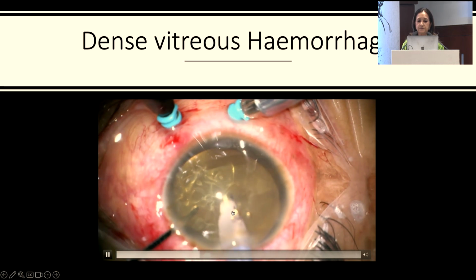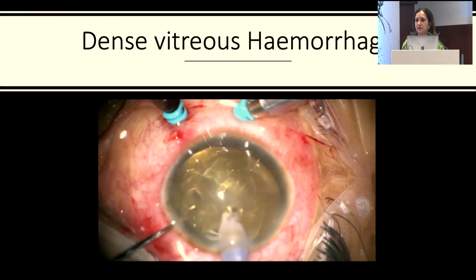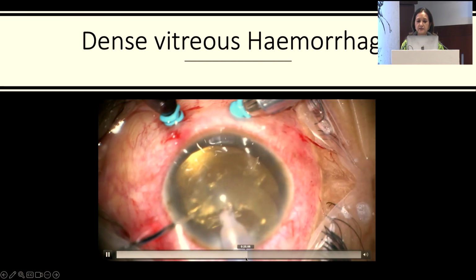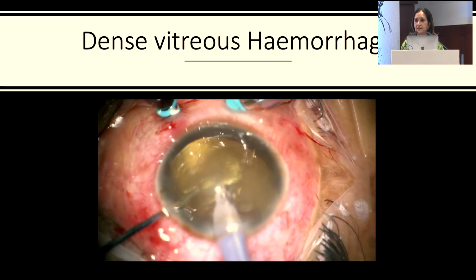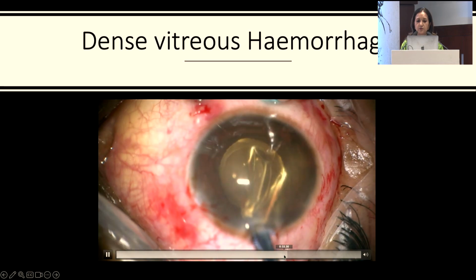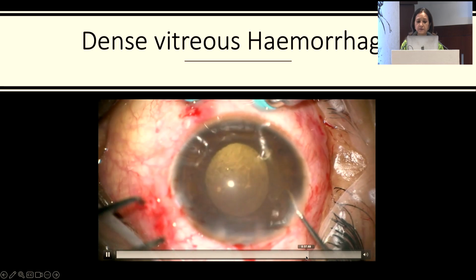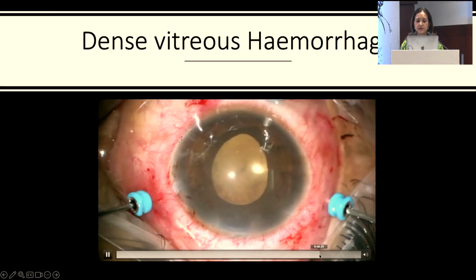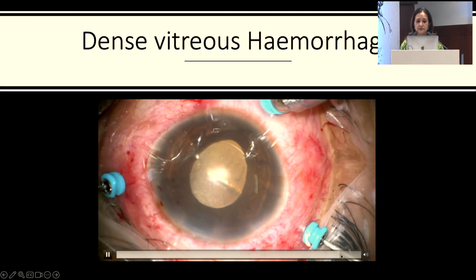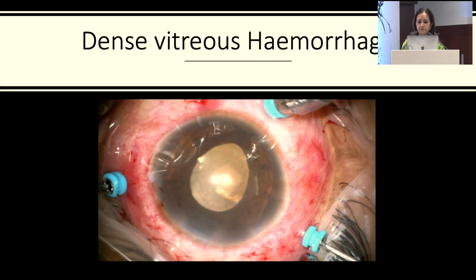Once you do a phacoemulsification with your chandelier inside, you are creating an artificial glow, and then you are able to clear the lens. The lens is not so hard, but because the capsule was fully dusted with vitreous hemorrhage, it had to go. You realize how dense the vitreous hemorrhage was once you have put the IOL, and then you see that I'm cutting the PC with the cutter. And now you realize how much it was blocking the view.